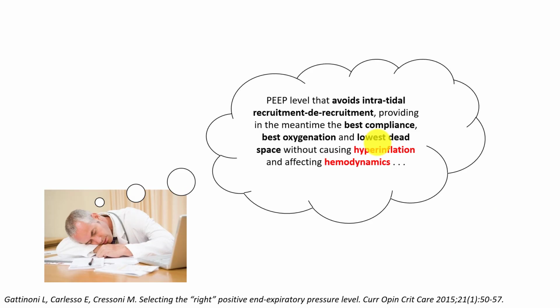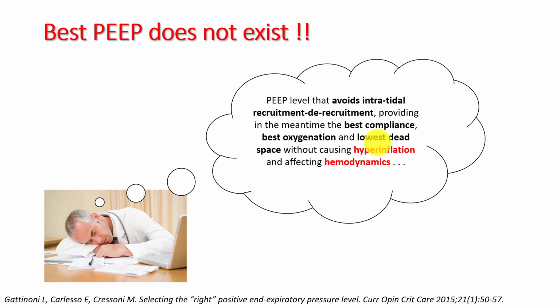It is said that a PEEP level that avoids intratidal recruitment or de-recruitment, provides best compliance, best oxygenation, and lowest dead space without causing hyperinflation and worsening hemodynamics is almost unachievable. Best PEEP in fact does not exist, but a better PEEP does.